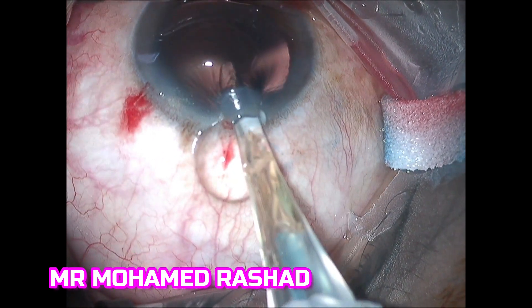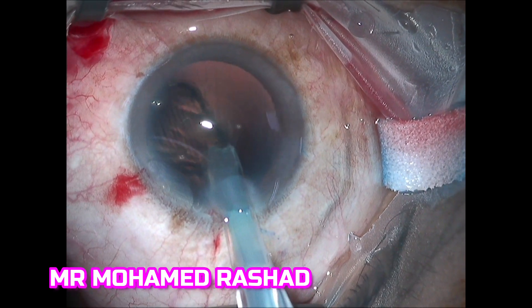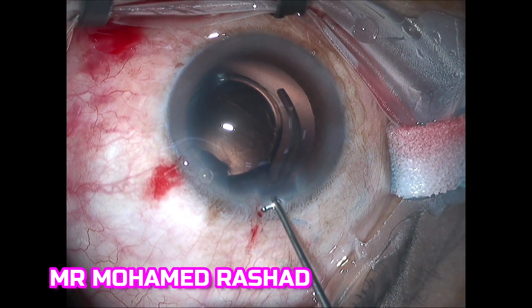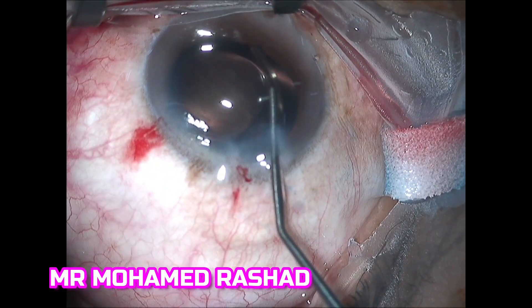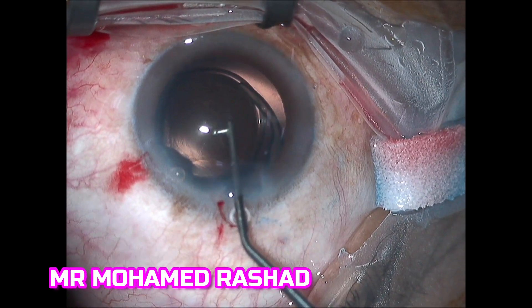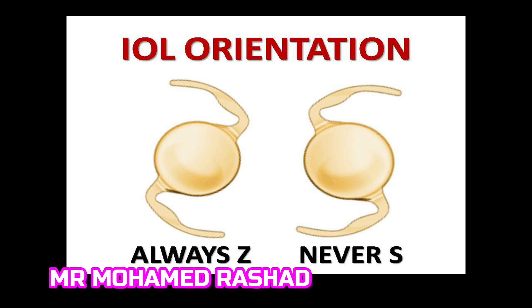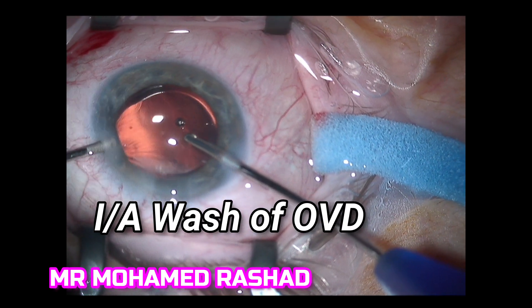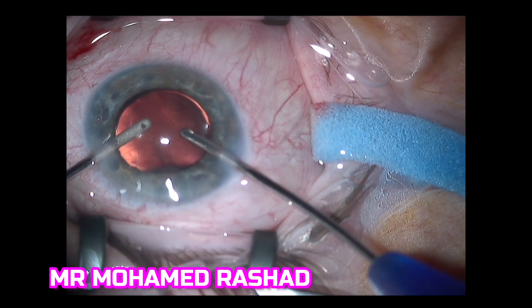Here is another case. You inject — the orientation is correct — and at the edge of the capsular rhexis. In another case, you can see that the haptic is not folding inside the bag. You can help it by using the dialer to push the optic-haptic junction and flex the haptic inside the bag. Remember always Z and never S — this applies to any IOL that has trailing and leading haptics. Then we wash the OVD from the front and back surface of the IOL.